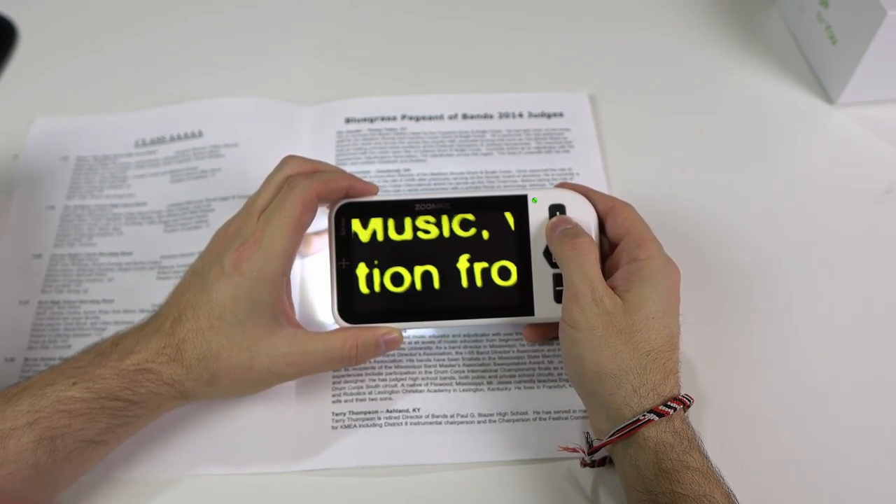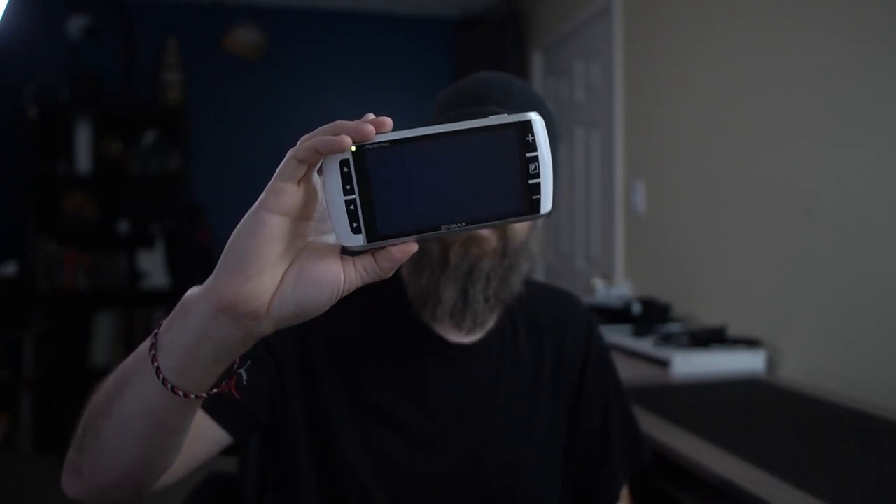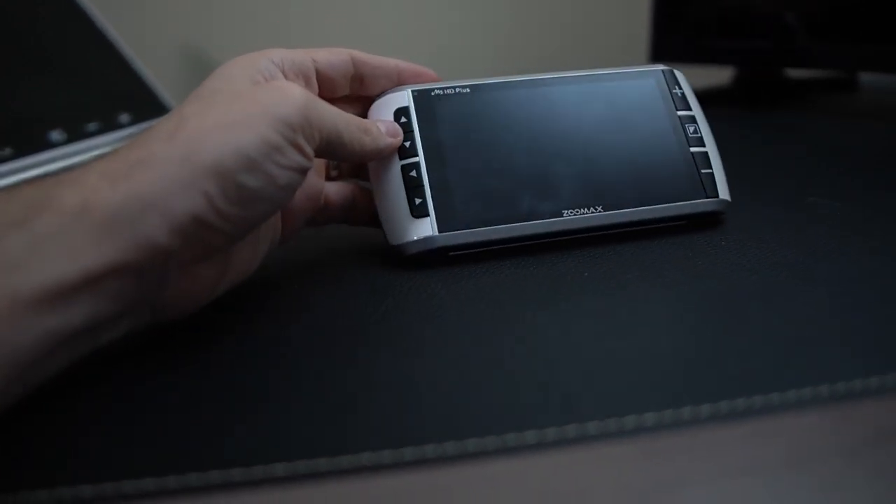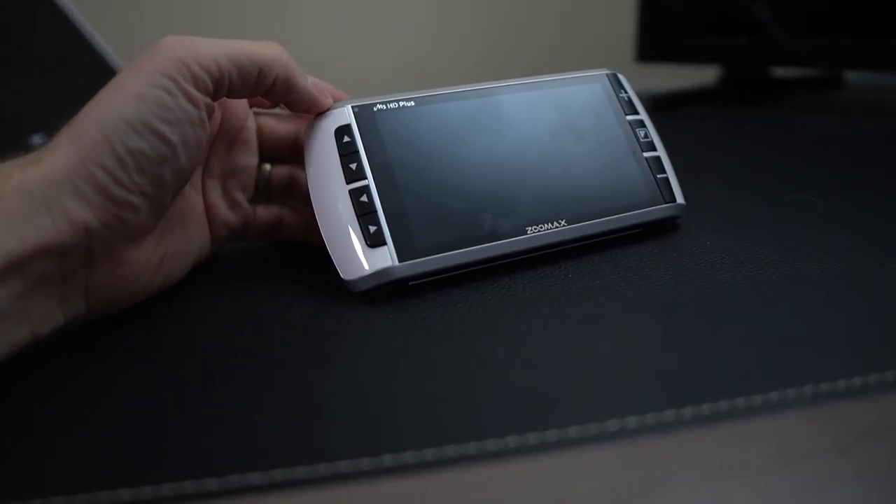Next, we have the 5-inch model. It has the stand, dual LED lights, full HD camera, and all the color combinations we're used to — including yellows, blues, greens, and all that. This one also has a camera button so you can snap a picture. The example I always use is if I'm shopping and there's something on the top shelf with a tiny price tag — even if I hold this up and zoom in it might still be difficult to see. So all I have to do is snap a picture, bring it down, zoom in, move it around and read it — it's much easier that way.